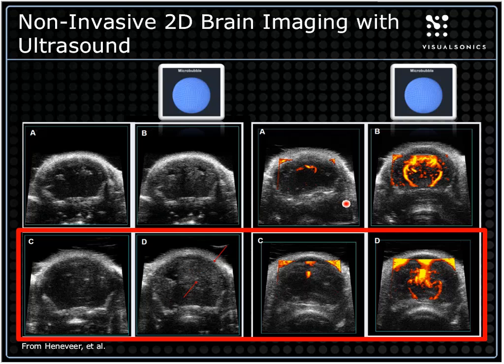Similarly, in the Doppler images where we're looking at blood flow, in a normal animal we see this healthy perfusion of the brain tissue through the major vessels here, whereas in the animal with the glioma, this is a grossly maligned flow here where you have hardly any flow where the glioma appears to be, and arguably a bit more flow on the contralateral side here. But this is very disrupted flow in that model. So we can then use contrast to enhance not just the anatomy and distinguish the differences in tissue, but also distinguish functional differences in things like blood flow.